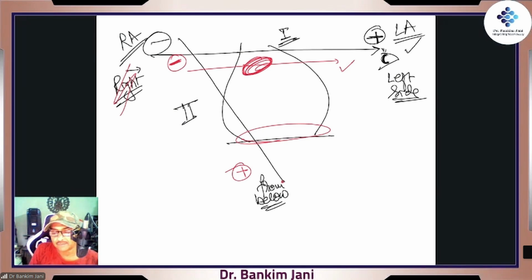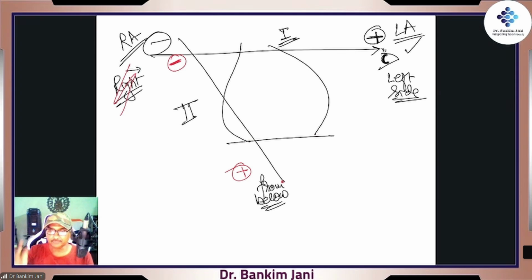Lead 1. But will this 2 be affected? No, 2 is going in this direction. 2 will be affected when there is basal diaphragmatic infarct. तो फिर वो रास्ते में आया है problem. Right? So yes, very rightly, you can see it like that whenever there is minus, that is beginning, and wherever there is plus, that is the point from where you watch.